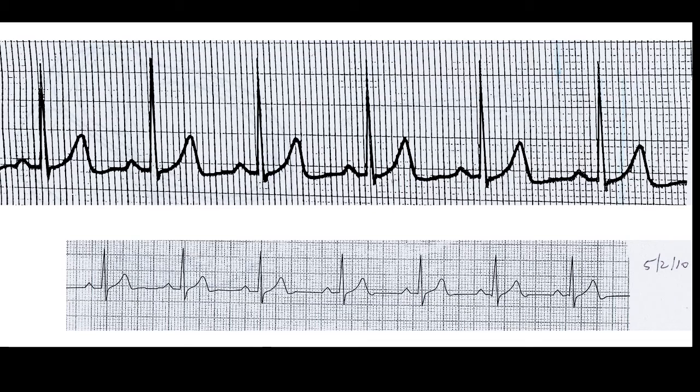If you look at the intervals on the same EKG, you can see from the beginning of the P wave to the beginning of the QRS complex, there's no Q wave. Often the Q wave is not present. You got 4 small boxes. Again, this EKG is slightly enlarged, and then you can do the math to get the 0.16 seconds or 160 milliseconds.